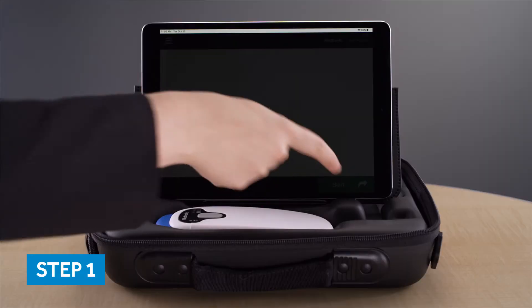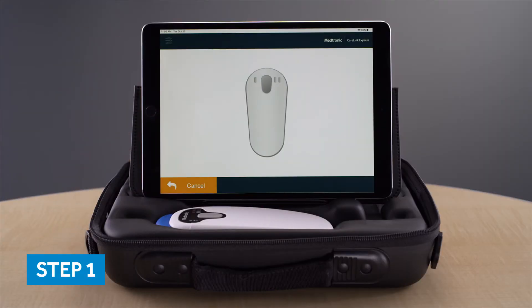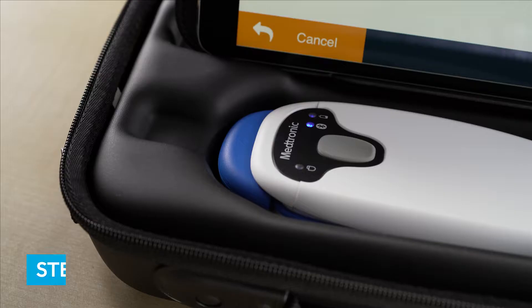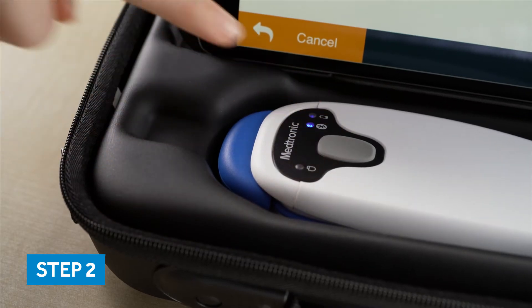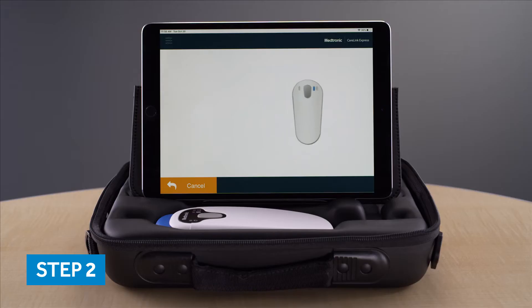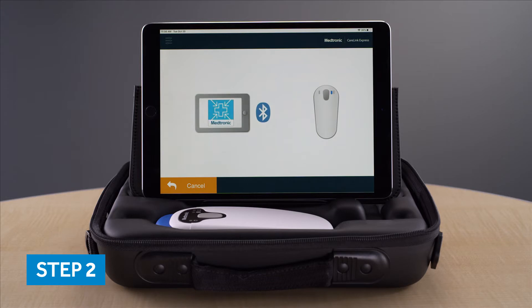Start the app and click the button on the patient connector. The app will need to be paired with the patient connector. This can be done by your Medtronic representative during the initial setup.